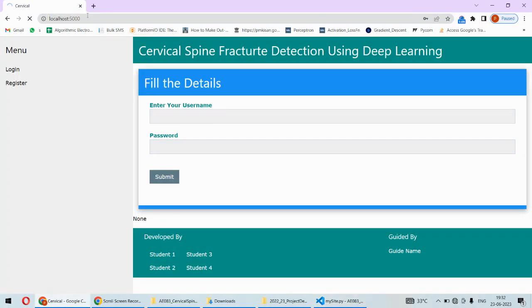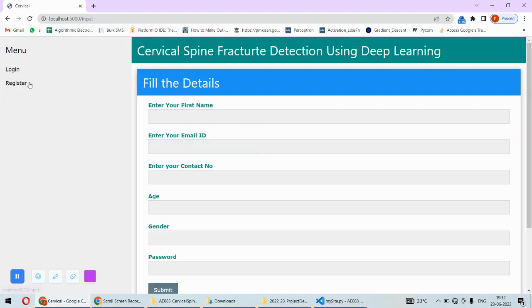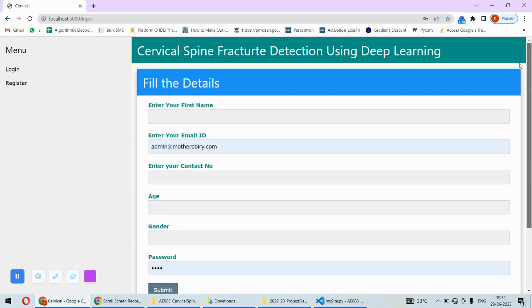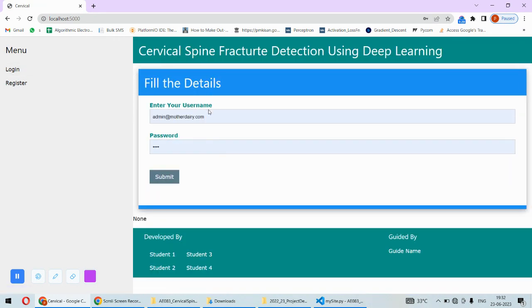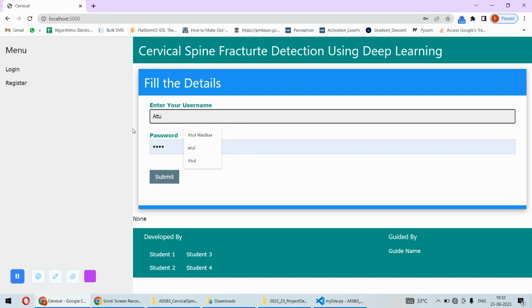Once we run this project we will have to hit the localhost on the browser, and then we need to log in using the login credentials. You can even register if you're a first-time user, or otherwise you can click on the login button and put your details and log in.